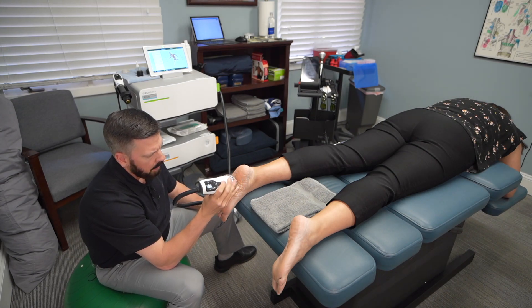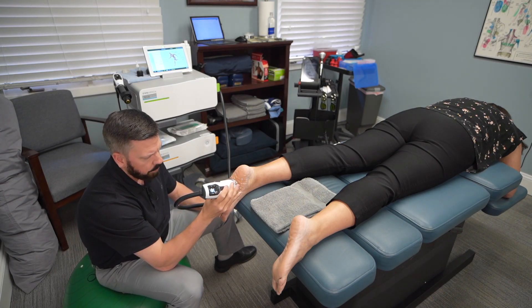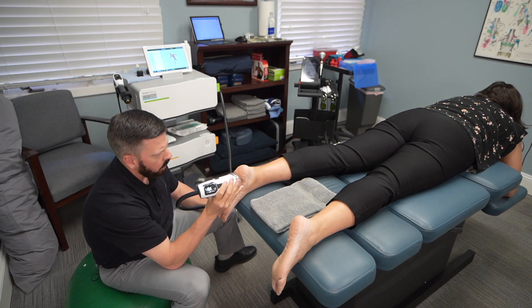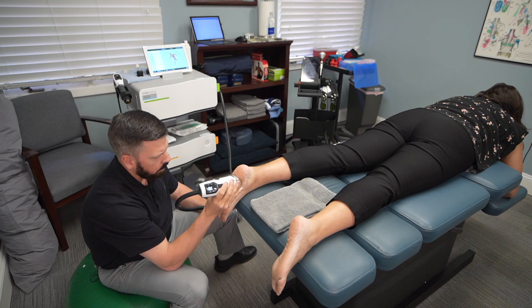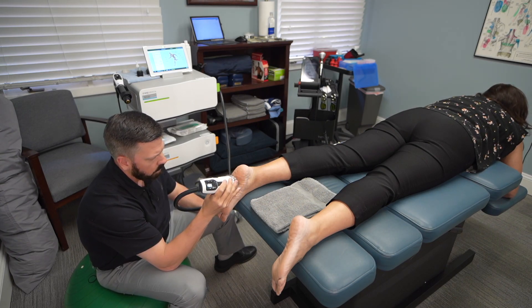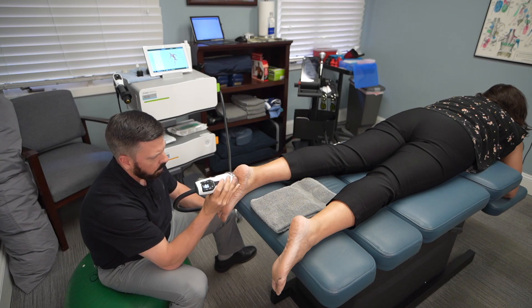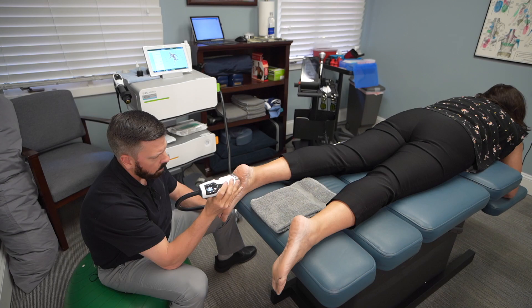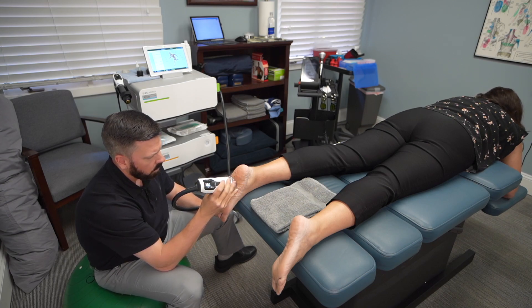The treatment time usually takes between five to ten minutes depending on the body part. So Renee, how would you describe what this feels like when we're working the plantar fascia? Certain spots that you go over I do feel a deep sort of achiness — it almost feels like it's reaching deep through my foot or through my heel, but it's very tolerable.